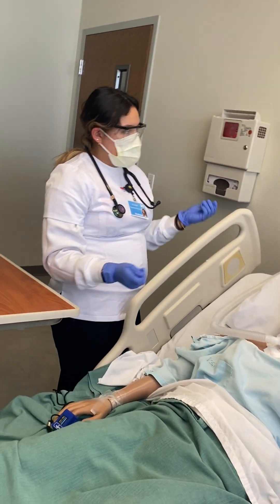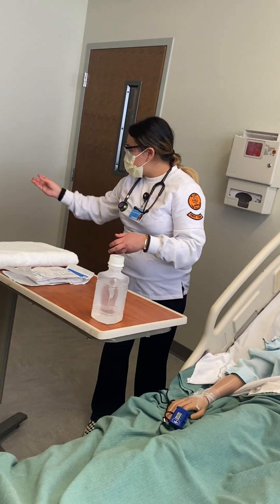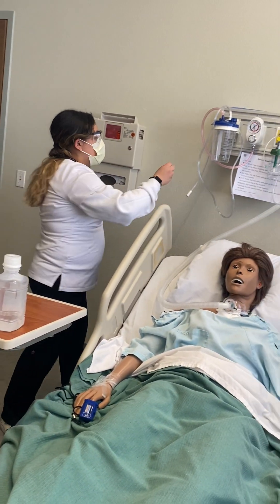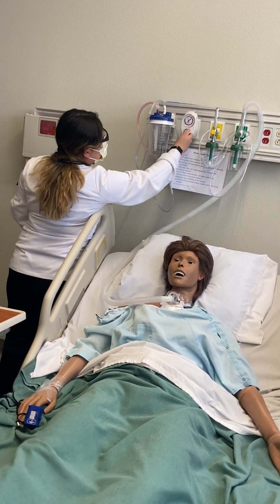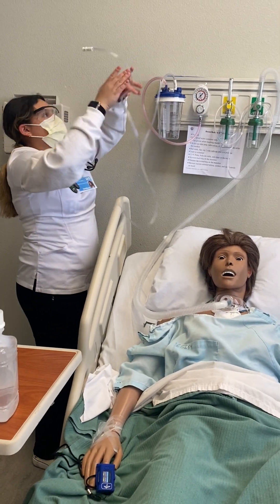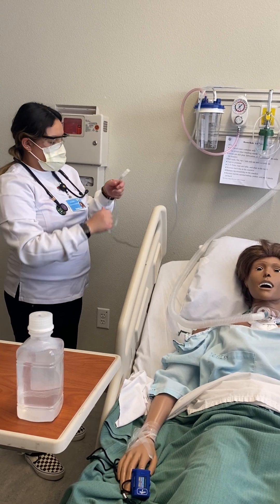I'm going to leave that pulse oximeter on, and then before I go ahead and set up my field, I'm going to go ahead and take off my gloves and throw those in the garbage. I'm going to sanitize my hands. I am going to go ahead and hyperoxygenate you to 15 liters. I'm going to turn on my suctioning, making sure that it's sitting between 80 and 120. Then I'll test that really quickly. My hands are clean. I'm going to test that suctioning. Okay, it does work.